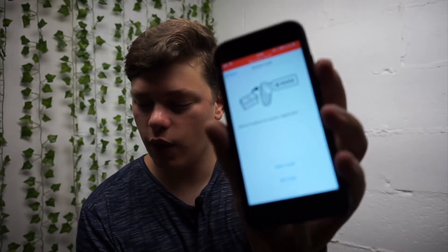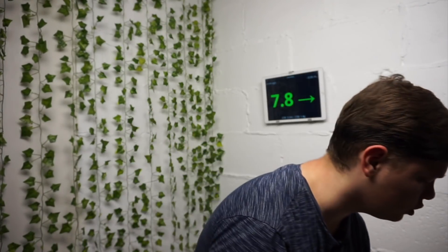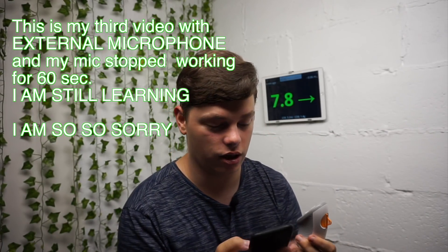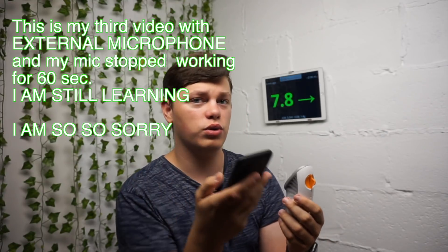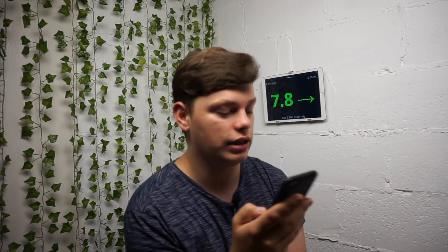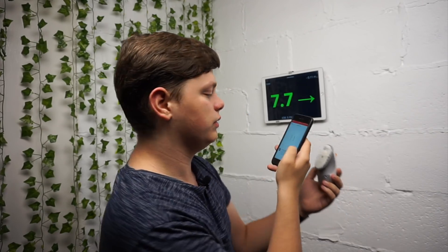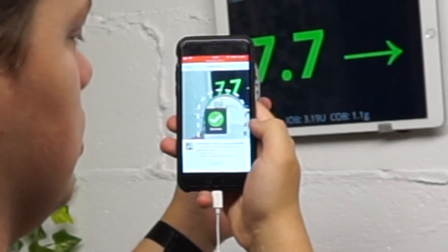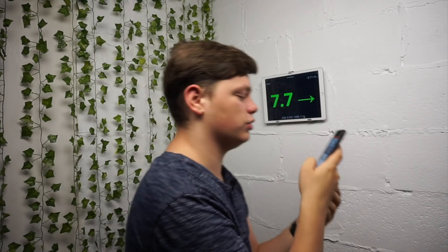Now with the Dexcom G6 app you are required to enter a code, and with every single application the code is at the bottom of the sensor. I'm not going to show you the code because I think you can enter it manually or you can take a photo of it. So I'm going to take a photo because that looks cool — and there you go, did you see that?